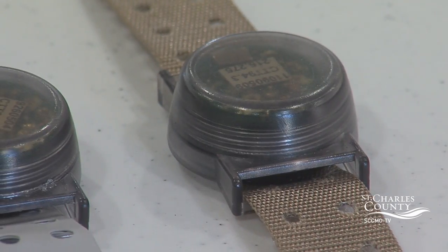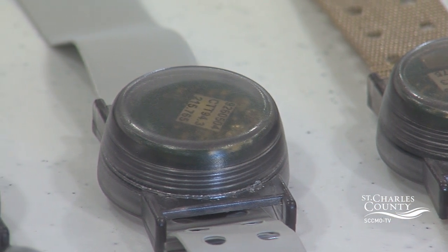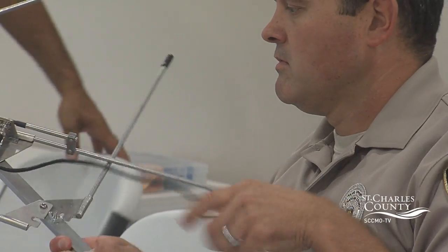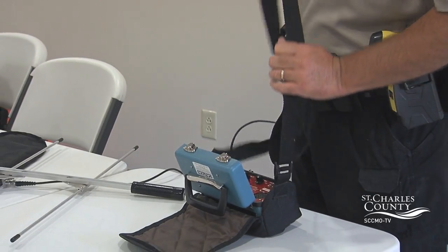Charles County Health Department. They actually are clamped on with specific clamps that are designed to not be removed. So we actually have to cut the wristband off to change the batteries, and we put a new wristband on and send the client back home. If they ever wander away from their caregivers, they call 911. We already know they're in the system. We immediately respond and start tracking from the last known location.